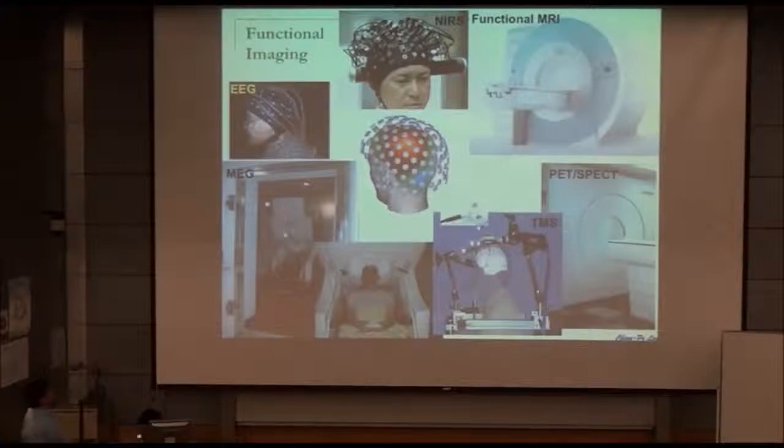So that's the reason why there's another technique, MEG. MEG is actually just to measure the magnetic field. What is the idea? For example, here is a neuron. If there is neural activity here, we know that there is a magnetic field here, right? So the basic idea is that we want to know where the signal source is. If we can detect a magnetic field, then we know that magnetic field transportation doesn't need any medium, so we can exactly locate the source.